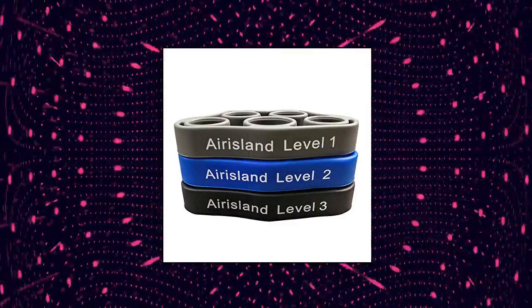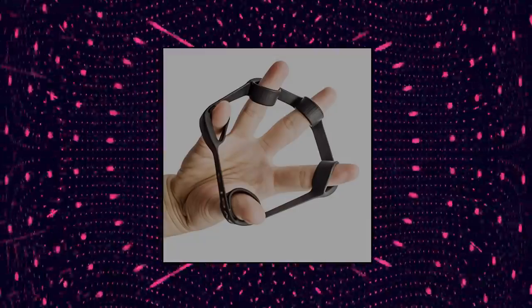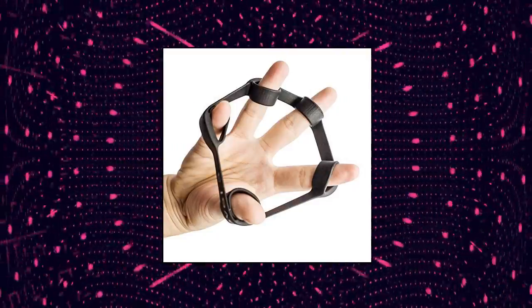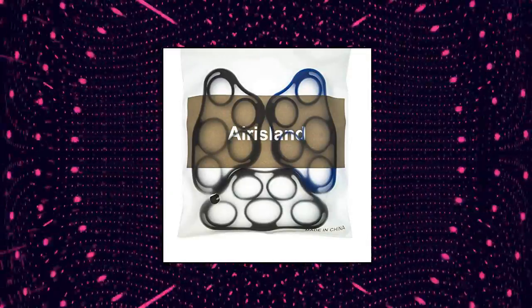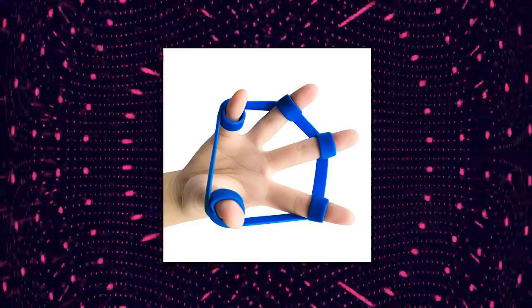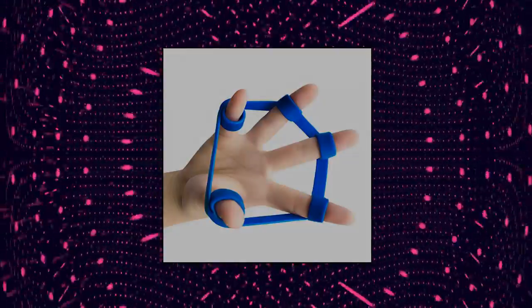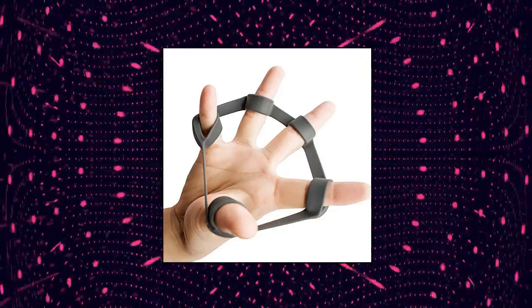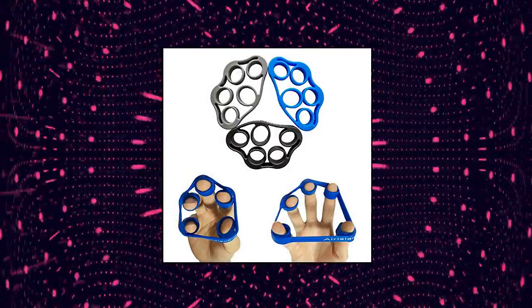Airisland finger stretcher hand resistance bands — make exercise simple. Finger resistance bands can improve finger strength for athletes and musicians. See results fast using your new hand exercise equipment. Use it anywhere, anytime. The finger extensor exerciser has a small size and modern look. You can use it while walking, traveling, in the office, school, watching TV or any place you want to exercise. Safe and durable, built with 100% first-grade silica gel, BPA-free. The hand stretcher is washable and lasts longer.